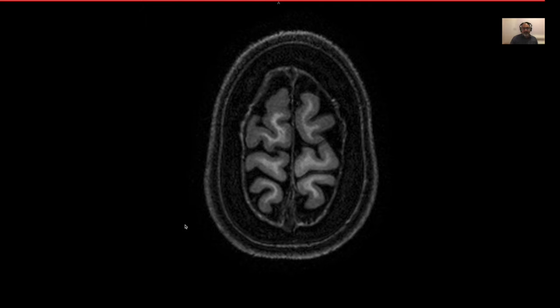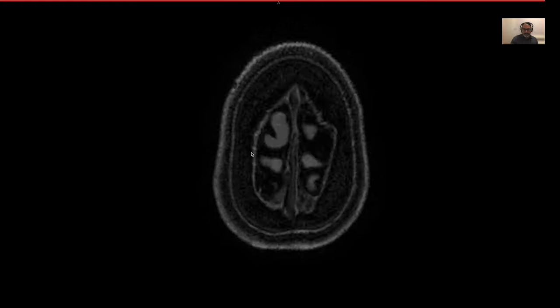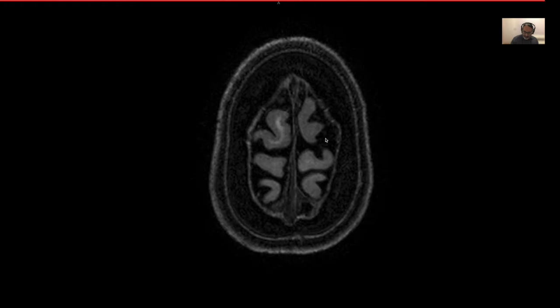All right, well, let's get into this. So here we are. We're just opening up the skull cap. That's the skin, then the cranium, and then as soon as you get through the cranium, you're going to start to see the cerebral hemispheres. In the cerebral hemispheres, one of the first things you see is the central line. That is the falx cerebri. That is the dura, which is also all around, going in centrally.